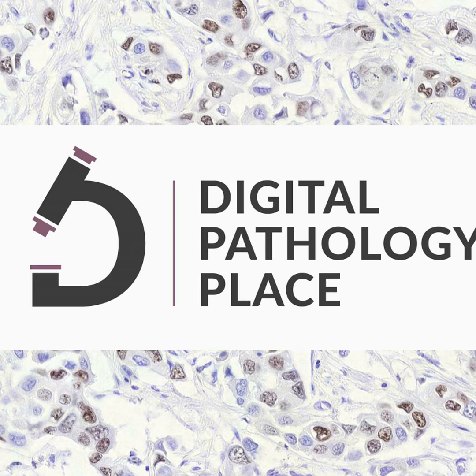So if you release a deep learning model that, let's say, segments glomeruli in a kidney, you should, along with it, release a summary of what that data set looked like in terms of quantitative presentation characteristics, so that you know if your samples are within that distribution, this is probably going to work for you. If it's outside of that distribution, maybe don't use it at all, or maybe be very cautious about it. That only works if everyone has the ability to do that.